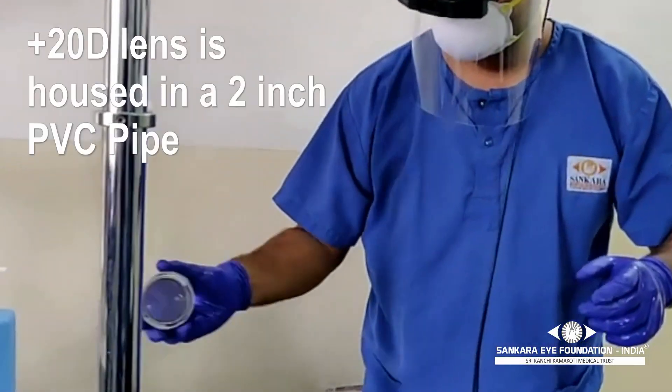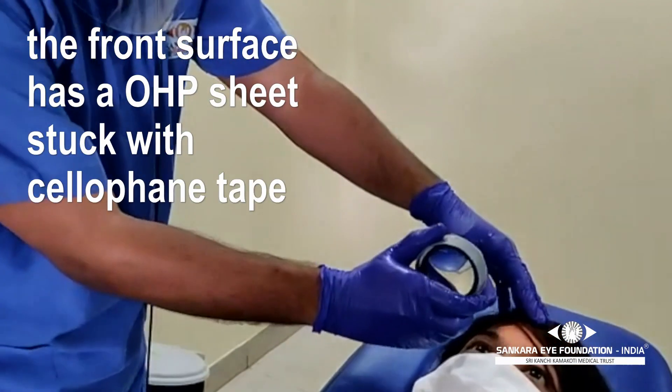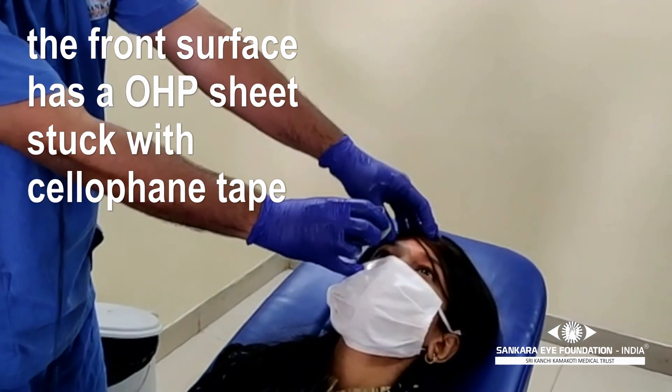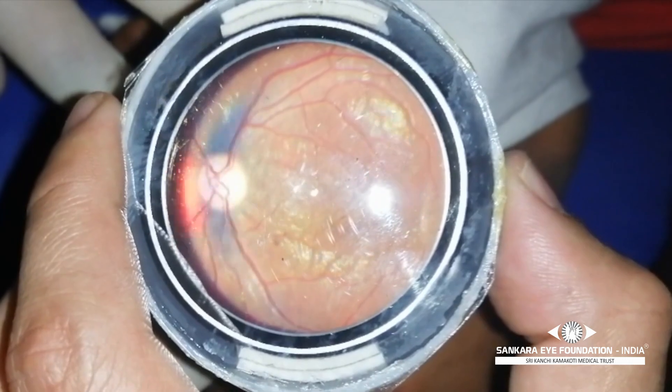Here we are using a modified lens for the examination. The front surface of the lens is covered with a plastic sheet, preventing direct contamination of the lens surface. This gives a good view of the fundus with minimal reduction in quality.